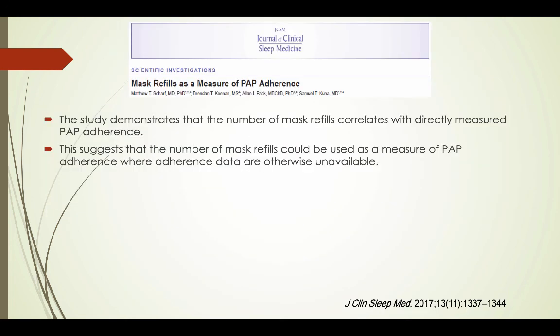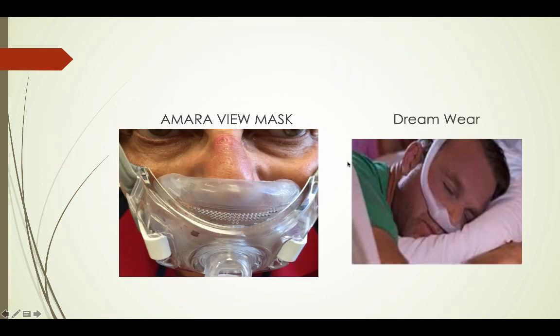And your mask refills, that is, how many times the patient changes their mask in the long run of therapy usage, can be an indicator of how adherent they are to therapy. So this study suggests that the number of mask refills, that is how many times they change their mask, could be used as a measure of PAP adherence where adherence data are otherwise unavailable.